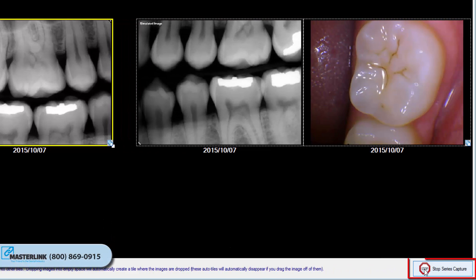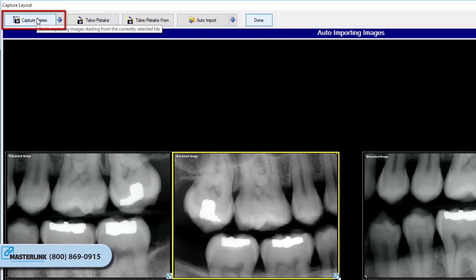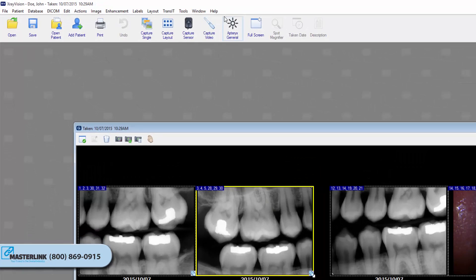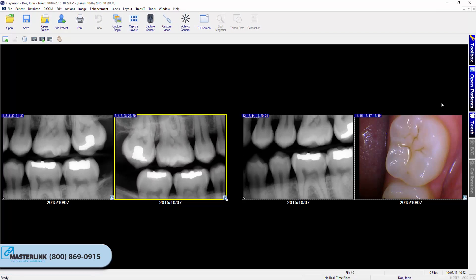The Stop Series Capture button is located in the bottom right of the layout capture window and allows the user to stop the automated series capture. The series acquisition can be restarted at any time by clicking the Capture Series button. If the user clicks the Done button, any captured images will be returned to the x-ray vision desktop, and empty tiles will act as placeholders for images that were not captured in the layout format.